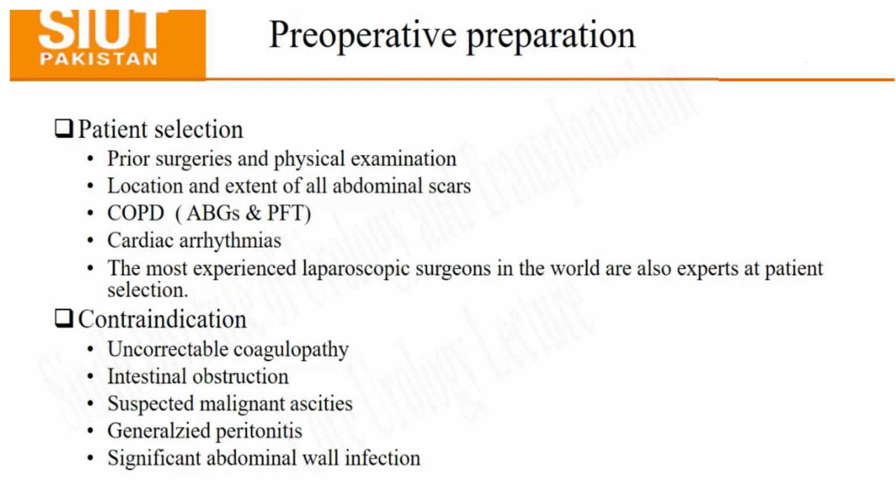And this robotic surgery is not completely autonomous. So this is a laparoscopic assisted surgery, robotic laparoscopic assisted surgery. That is why we get benefit from that. But I would like to update that the latest da Vinci robot, which is made by the Intuitive company, has given tactile feedback in robotic surgery as well. As things are improving, science is taking its course and recent advances are coming. They are working on it, and we give very good feedback on whether these things should be included or not. So about the tactile feedback, in the near future we will also be able to have it.